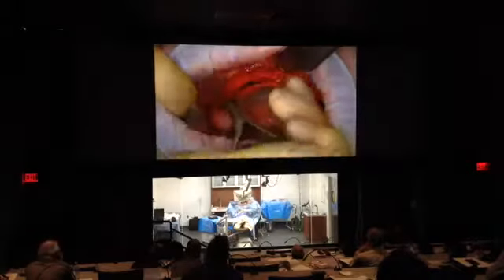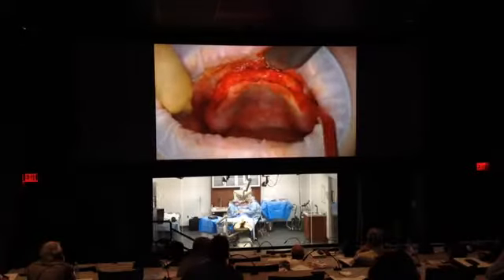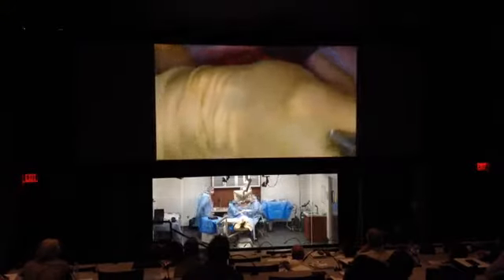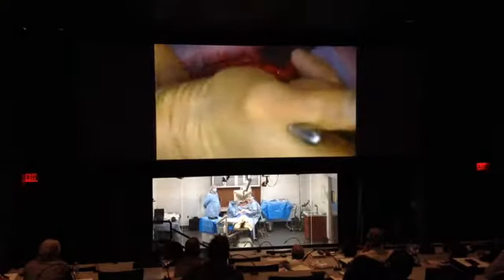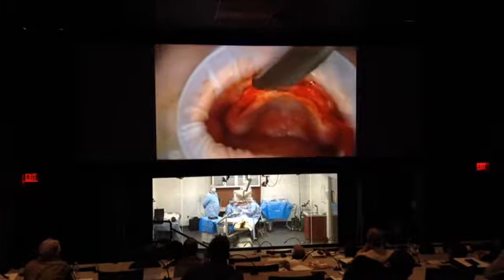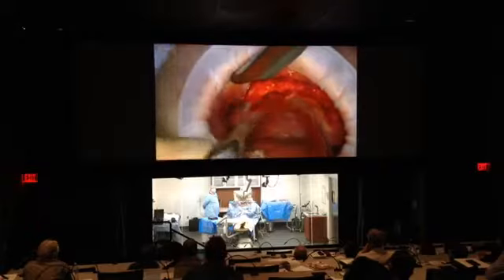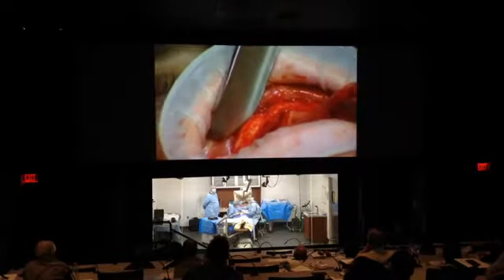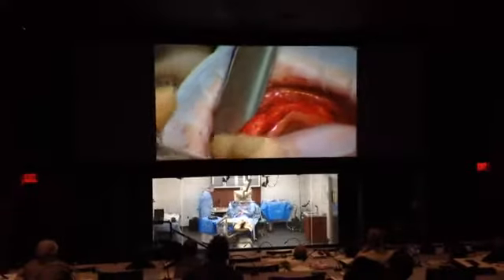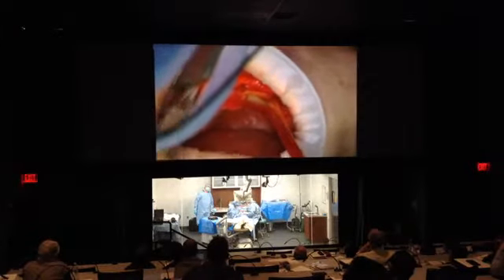On your two posterior locations, is it important that they are in the same relative position on the ridge for stability, or does it matter? That's a good question. Sometimes it depends. Not everybody's sinus is symmetrical. So we just go at the distal most posterior part where we don't penetrate the sinus. I try to get it symmetrical as much as I can, just because I like symmetry, and I think as human beings we like symmetrical things, but it's certainly not necessary. It just depends on the bone available. Great, thank you.